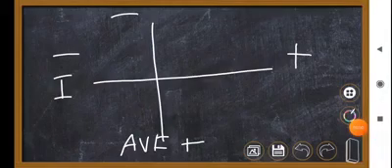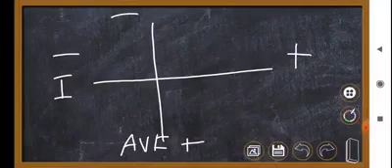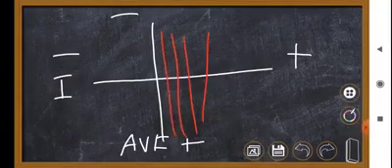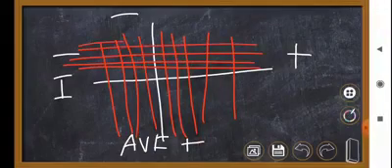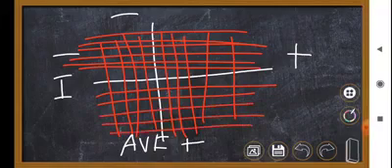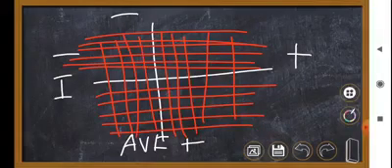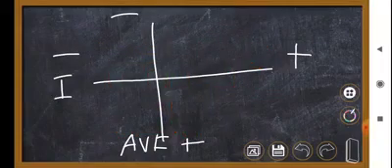Ideally, these calculations should be made on a graph paper, but we are going to assume that it's a graph paper and it has got equidistant squares like this. Clinically or in hospital, we can also calculate on an ECG strip, which is almost the same as a graph paper, as it has got equidistant squares. So we are going to put the RS difference values that we calculated here.